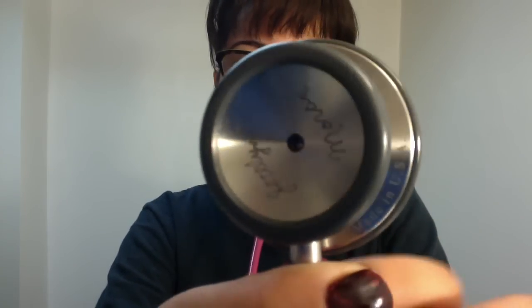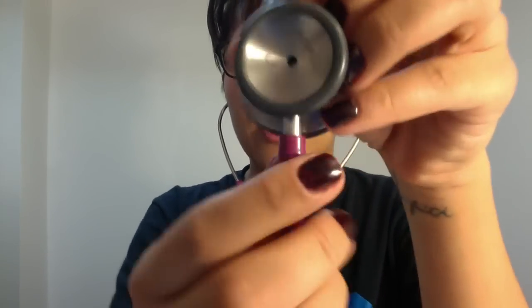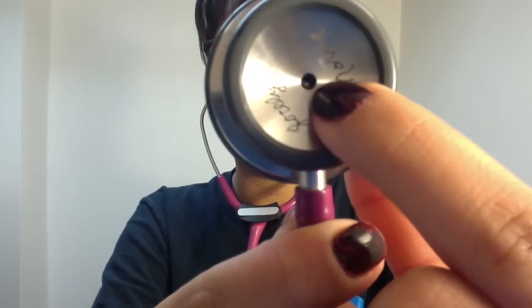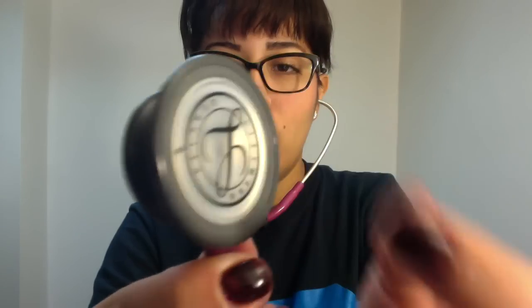When it comes to taking somebody's blood pressure, if your bell is open — which you can see there, you can see the hole — you can't hear the blood pressure when you put it on their arm. So before you take a blood pressure, you want to make sure your bell is closed. If you want to try this out, put the ear pieces in and tap the bell when it's open — you can't hear it. But when the bell is closed and you tap it, it's very sensitive and you can hear it very well.